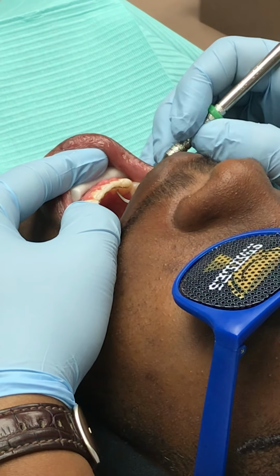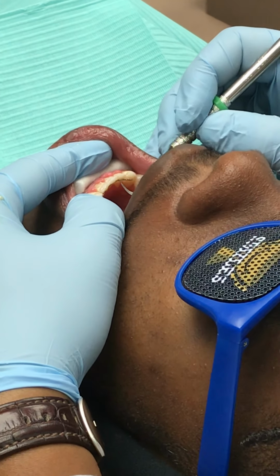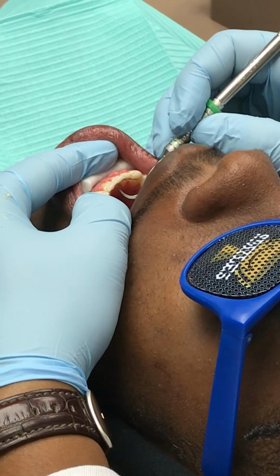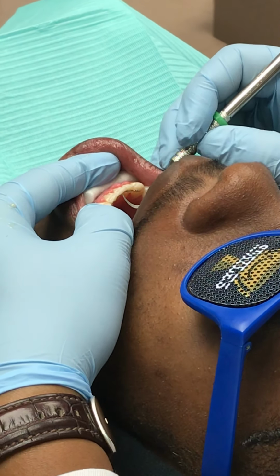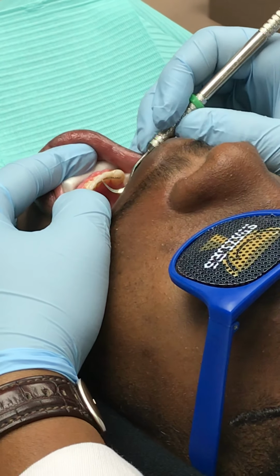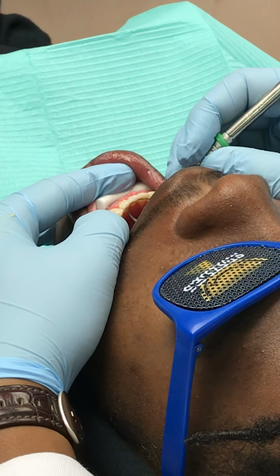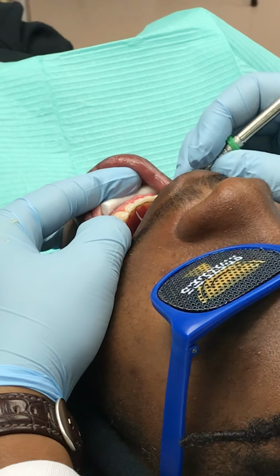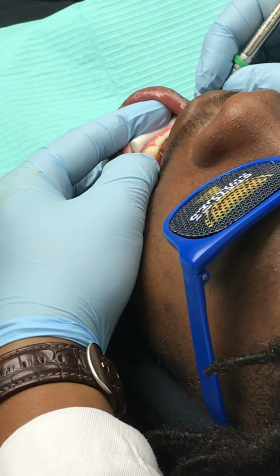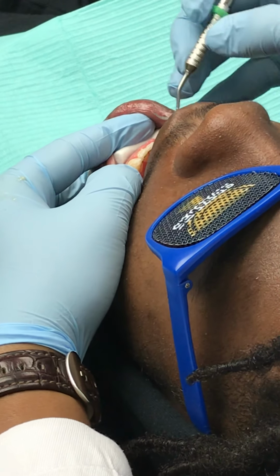So I'm gonna check for that on all 5 of the teeth where the wire is bonded. I'm also looking to see if there's any rough areas or any areas that jut out from the adhesive. My goal is, what I'm hoping to see on each one is, for example, if you can see how this scaler is moving, it just goes smoothly from tooth to adhesive to tooth. That's exactly what we want. That's going to be the most comfortable for the patient. So far, we're good to go everywhere except for that lower right canine. Everything else is nice and smooth, okay?